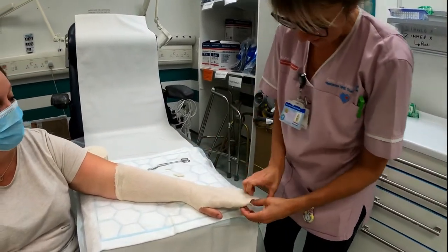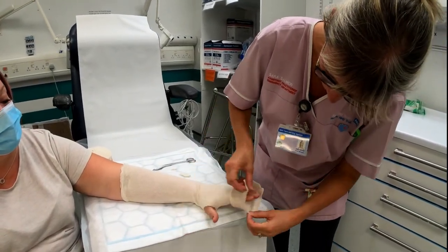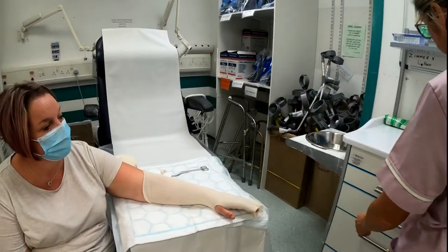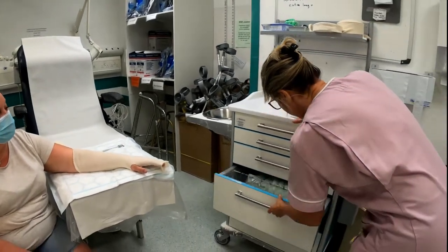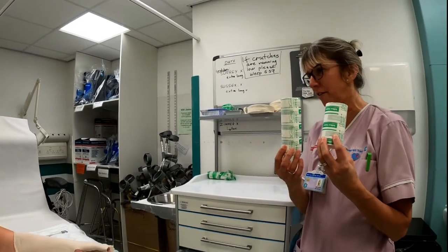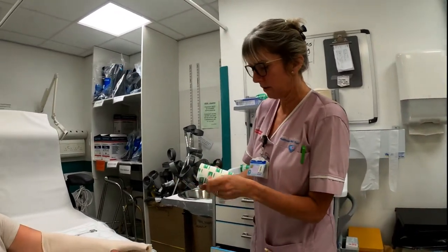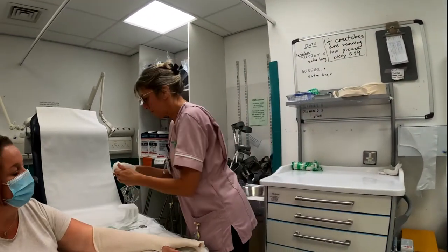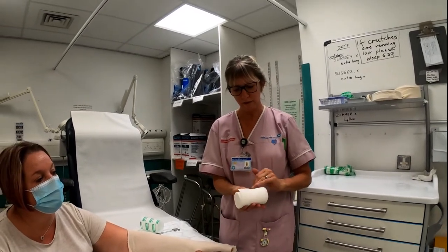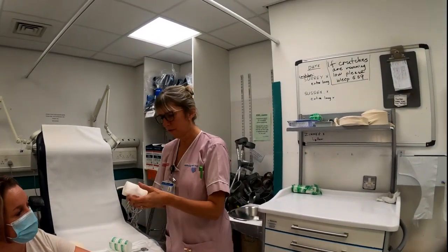Then we do our little 'cheese slice' on the end, which enables us when the cast is done to turn it back so it will go around the thumb neatly. For the soft band, use the middle size, not the full size, because otherwise you'll have trouble getting it around the wrist. Take the edge off because otherwise the soft band doesn't stick to itself — it gives it a smoother finish and helps with application.